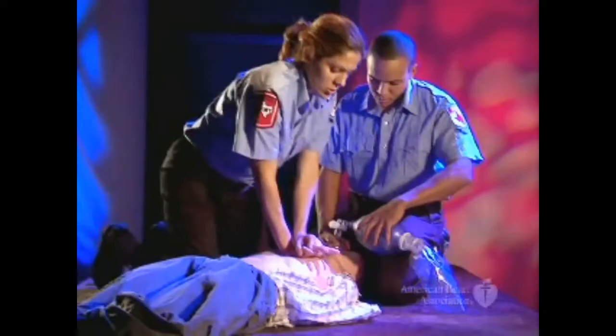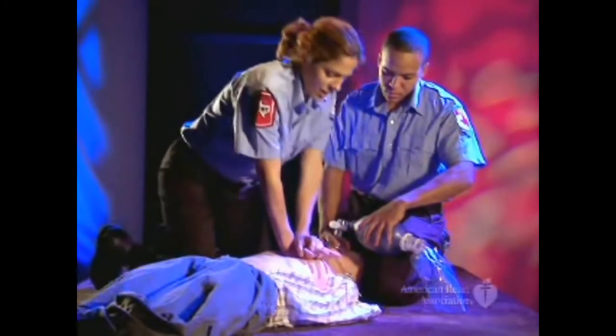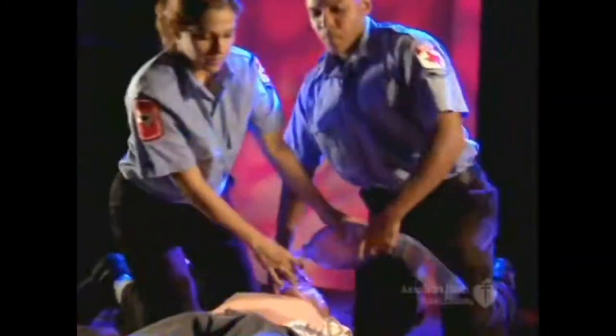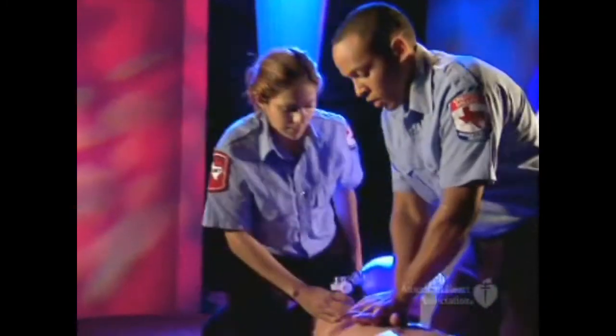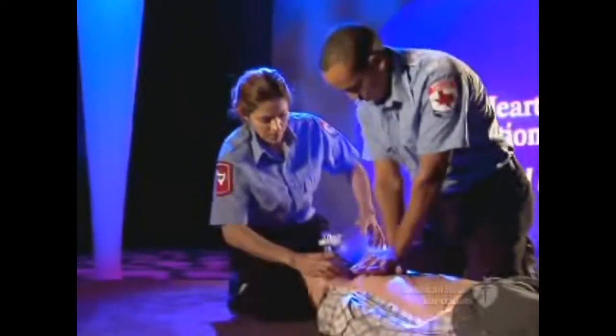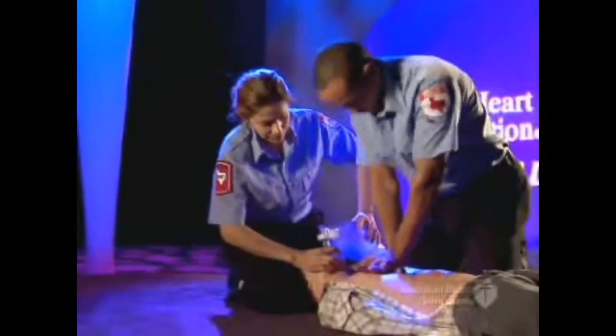This will help reduce the chance of gastric inflation, air going into the victim's stomach instead of his or her lungs. If too much air enters the stomach, it can cause vomiting and potentially aspiration. If you're performing 2 rescuer CPR, you can use the EC clamp technique to hold a mask in place. This technique requires instruction and practice.